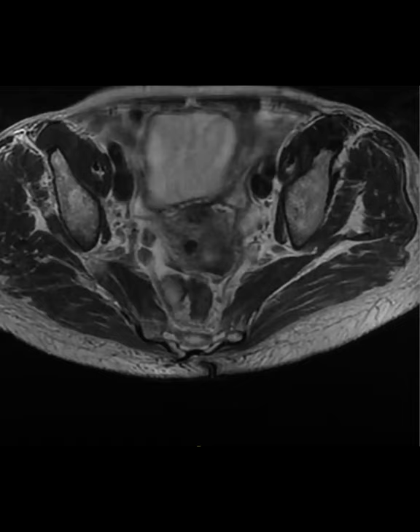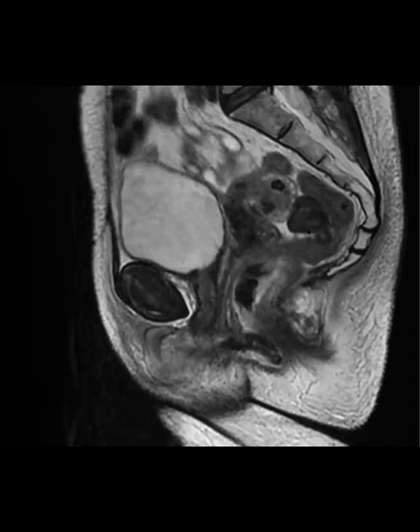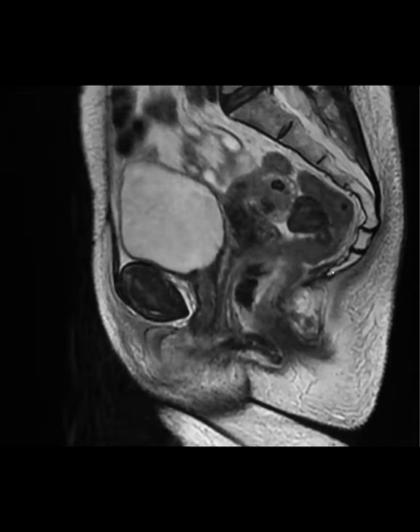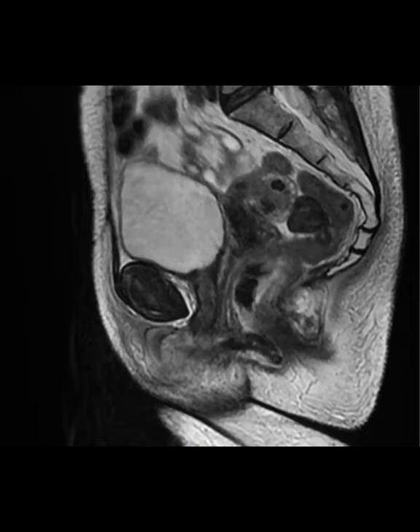So the sagittal is here. Looks like it might have a point of contact with the uterus. Yeah, it looks like it's right here, right? Maybe here, it's kind of touching the uterus, and then you get to this thing here. So is it just a weird pedunculated fibroid with maybe cystic degeneration of just one very well circumscribed part of it? I just don't know what else it could be.